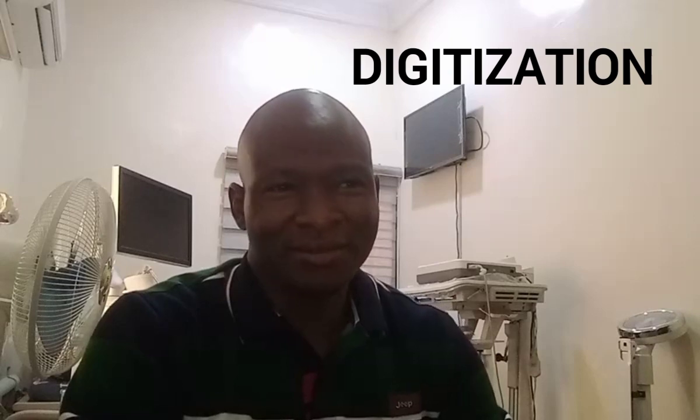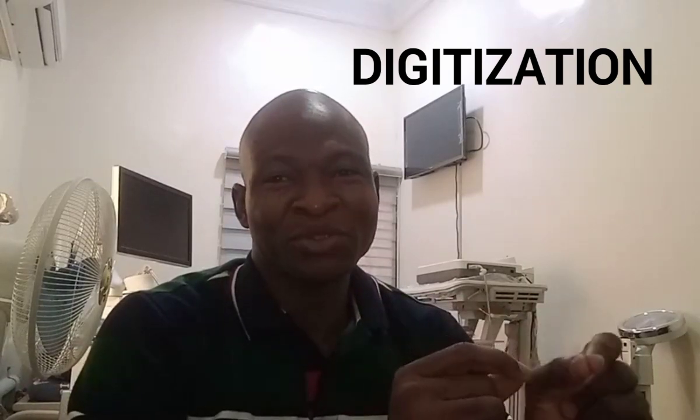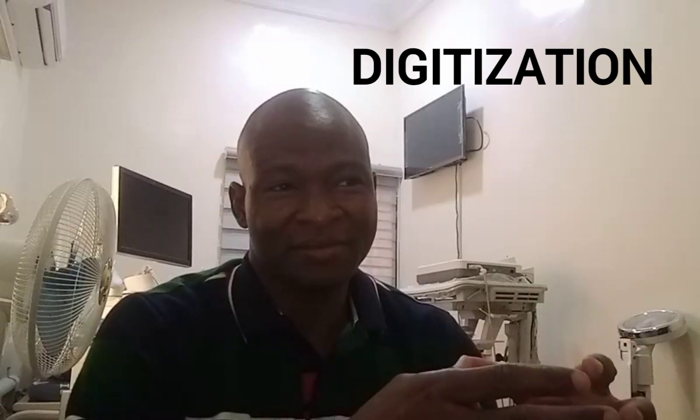So let's look at digitization. What does it mean? It simply means to assign the signal a number that is proportional to its amplitude or strength. For example, the amplitude of an echo coming back from a strong reflector like the adult diaphragm might be assigned the number 100, while a weak echo from soft tissue might be assigned the number 25. Basically, that's what you do in digitization.